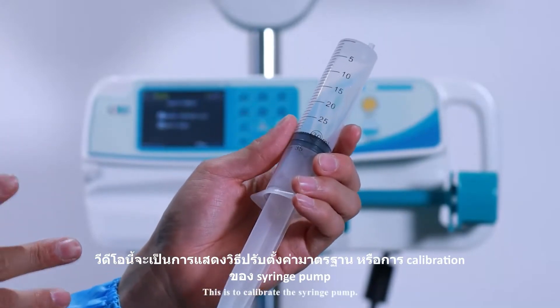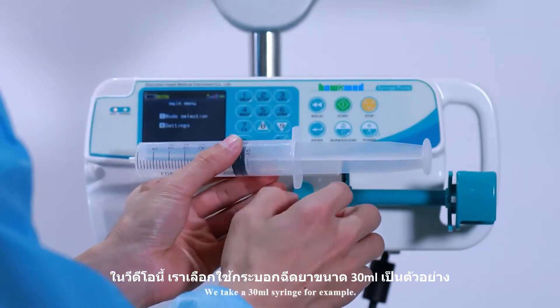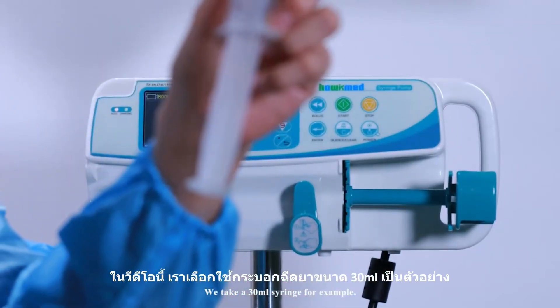This is to calibrate the syringe pump. We take a 30ml syringe as an example.